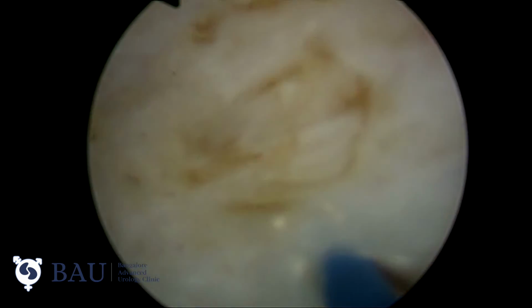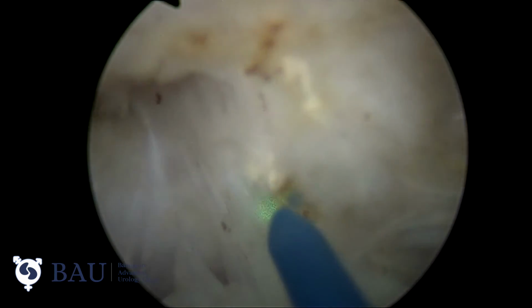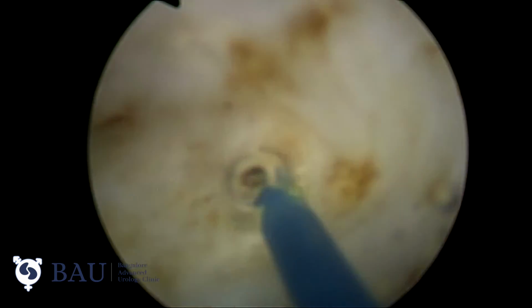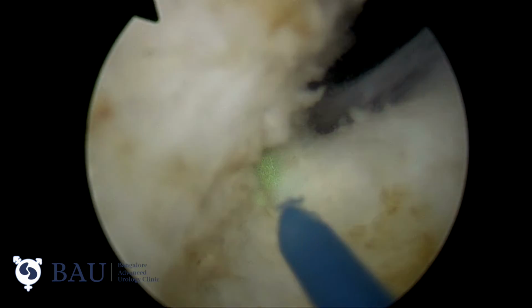Be close to the prostate adenoma as much as possible. Never enter the capsule in this area, that can create a lot of complications.